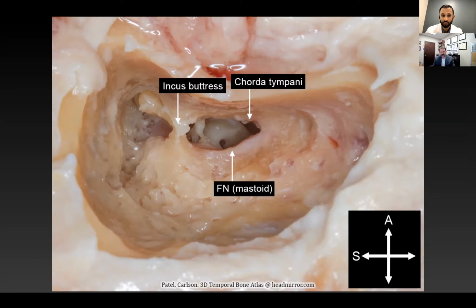Knowing where your round window is is nice, particularly for a cochlear implant, because that tells you where your basal turn should be. And technically, if you're opening your round window, you're going to enter scala tympani by definition, which is the ideal placement for a cochlear implant. But this anatomy locks in, and it's always the same on everybody.